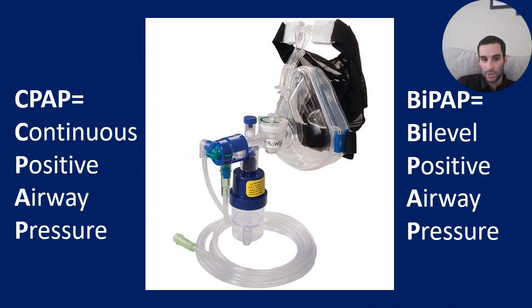Now, if it's a CPAP machine, it's a continuous pressure. If it's a BiPAP, and again, BiPAP actually refers to a commercial product, so I'm going to also use the word BPAP, which just stands for any generic setup. And this is a common setup that is used in the pre-hospital setting. That can actually put an inspiratory pressure and then hold an expiratory pressure, so there's two levels. I'm not aware of any BLS agencies using BiPAP, so you can focus mostly on CPAP for the purposes of this talk.